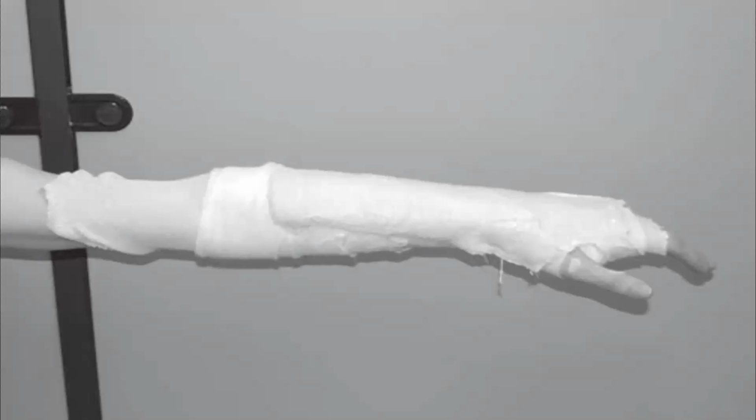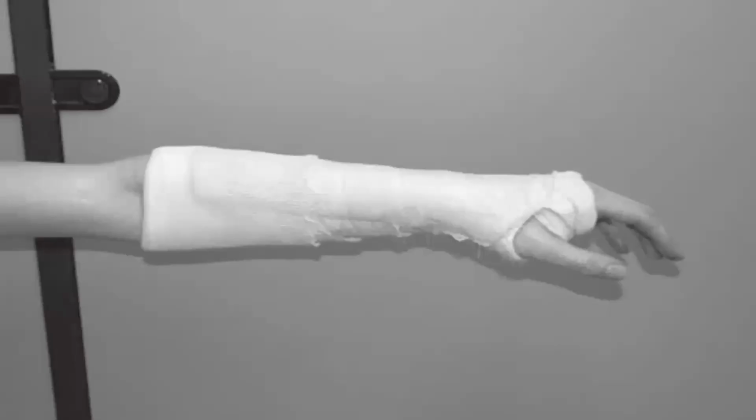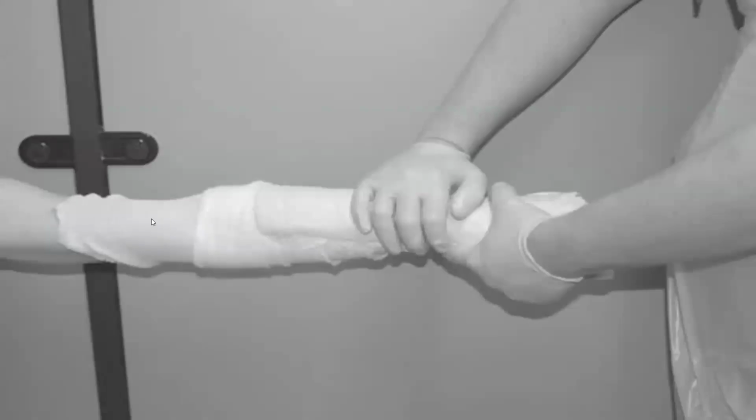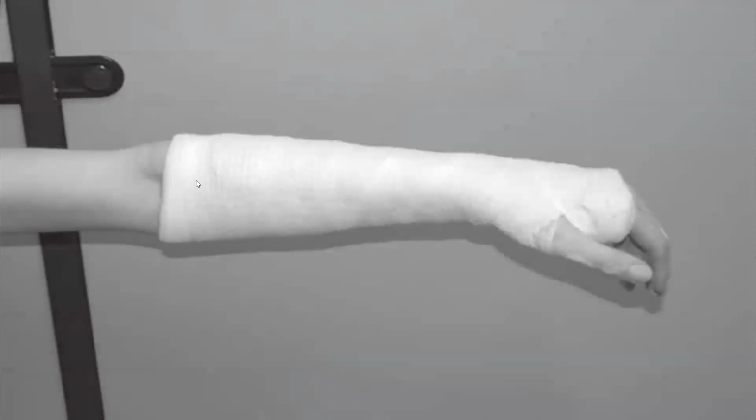Then I will do molding or smoothing. Then I will apply the crepe bandage. Okay, first, before applying the crepe bandage, I will flip the stockinette from the elbow down and from the metacarpophalangeals up. Then I will apply the crepe bandage to the patient.